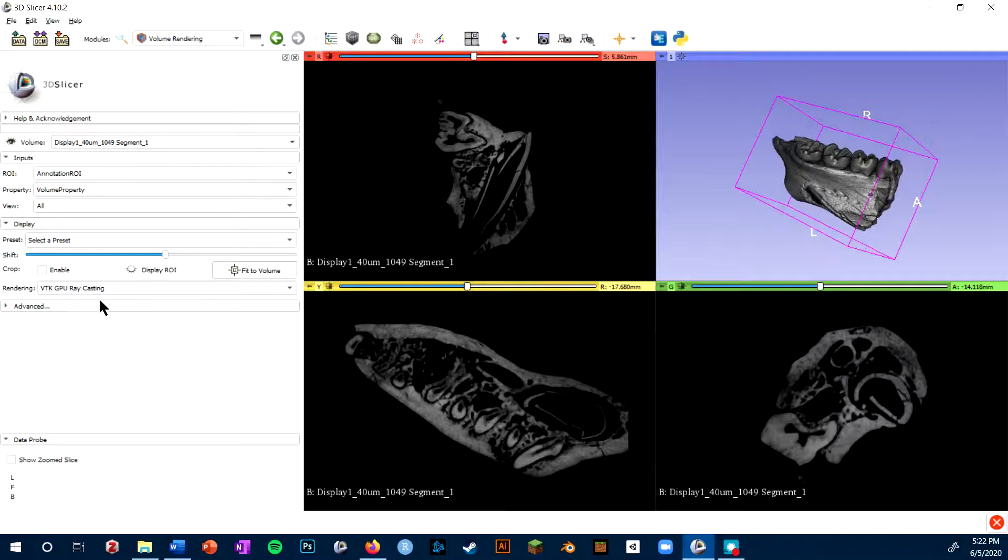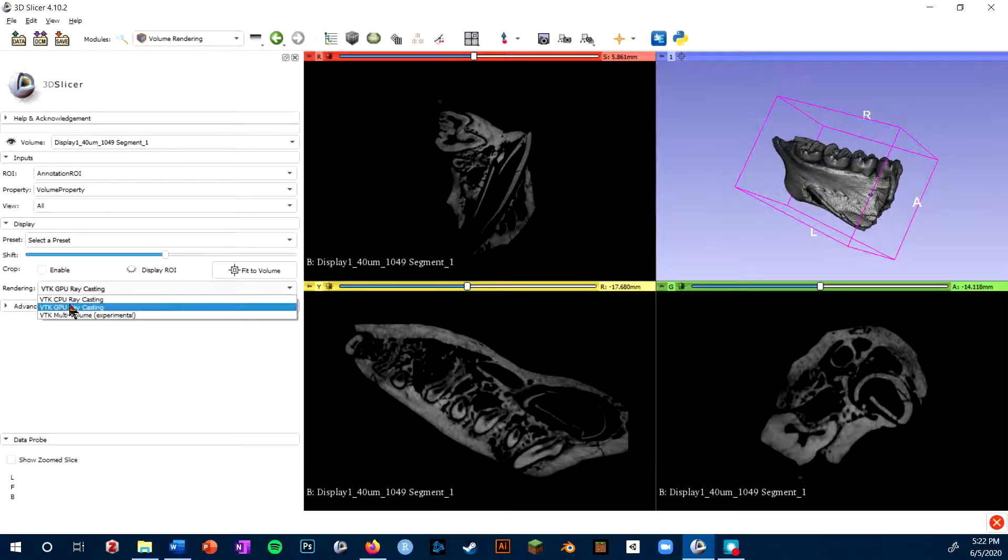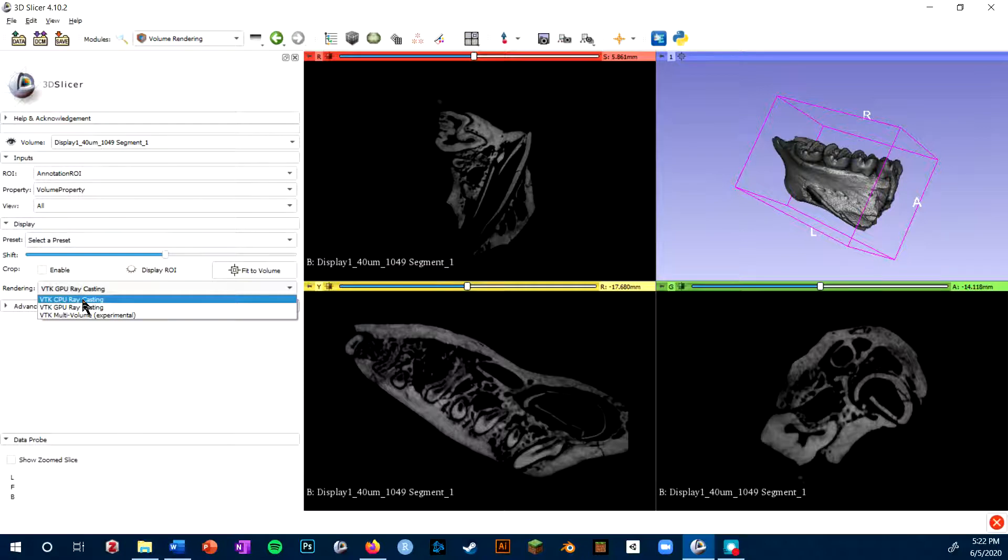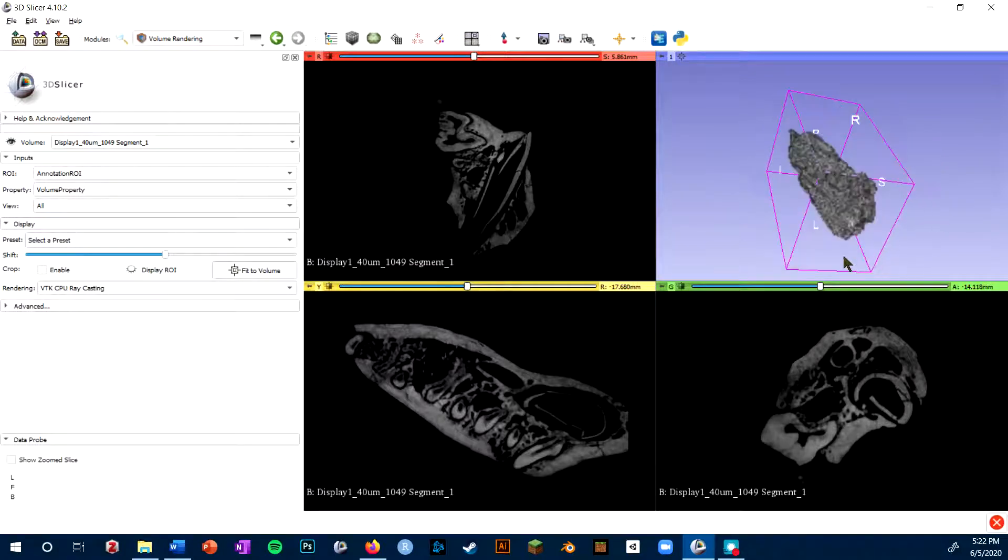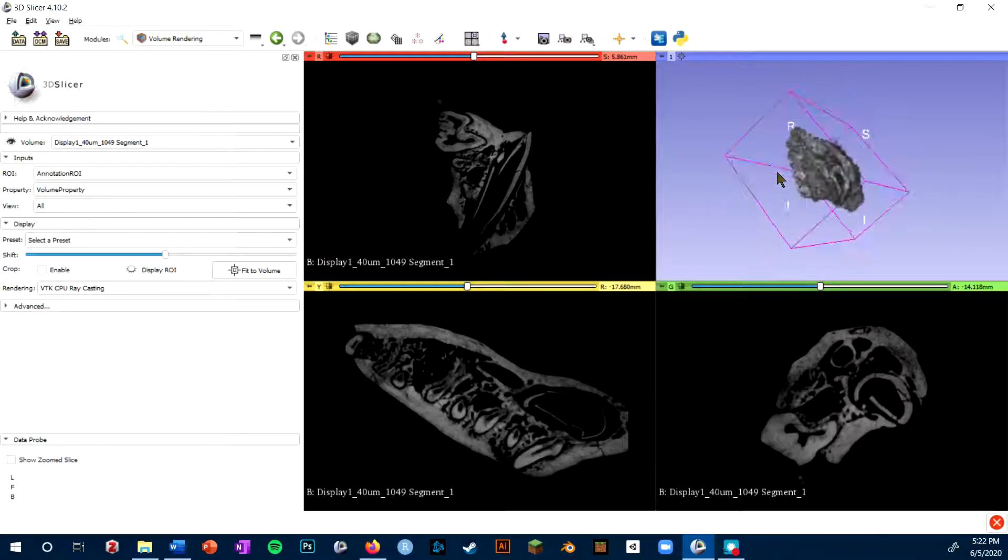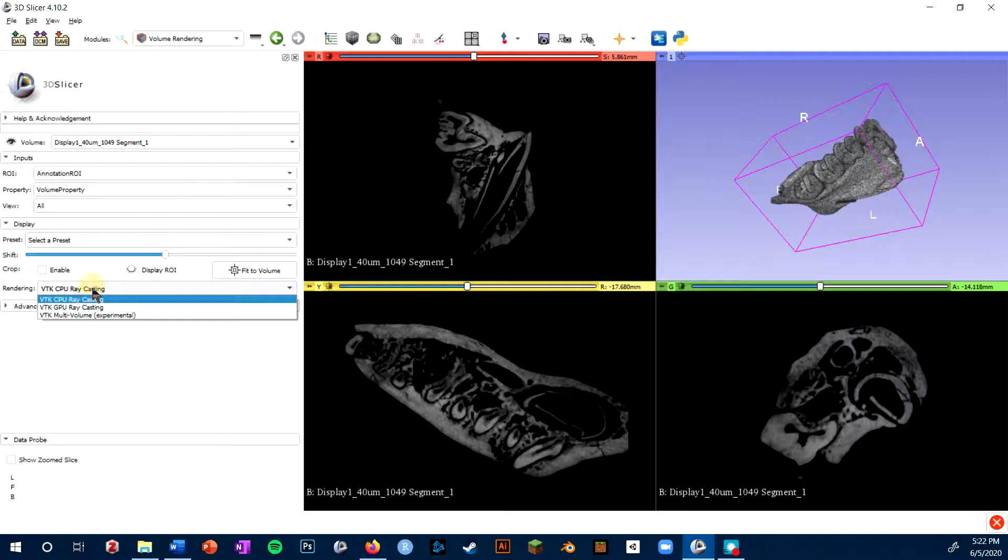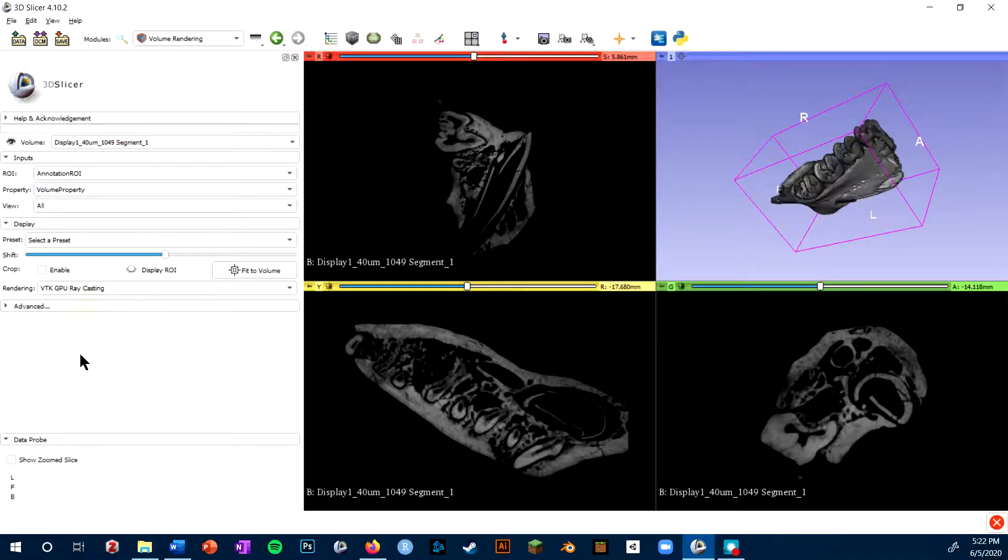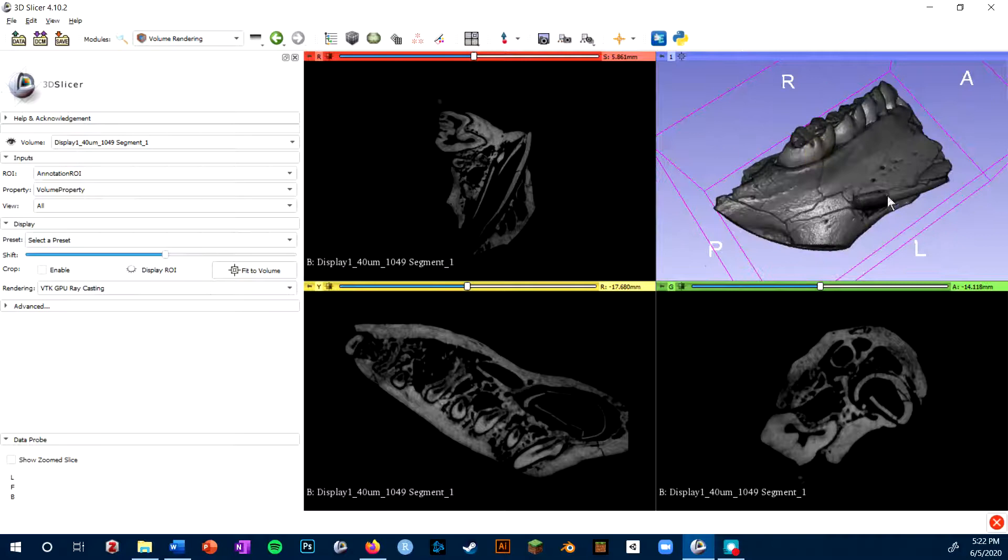Now one thing you'll notice is you will probably have VTK CPU ray casting as the default. If that's the case, your volume will probably look somewhat grainy like this. I highly recommend working with Slicer on a computer that has a GPU so you can use the GPU ray casting, which tends to look much better.